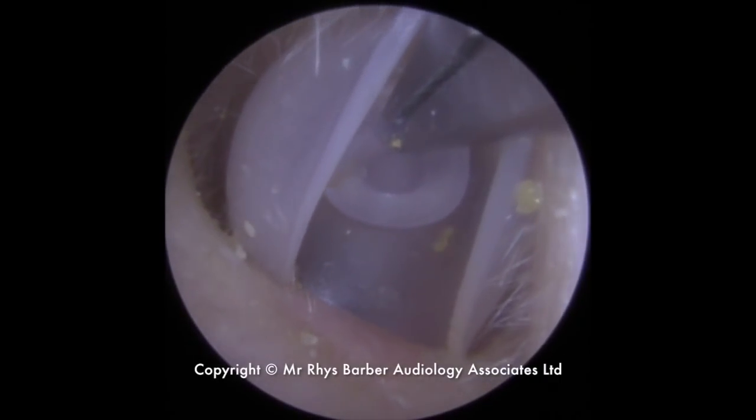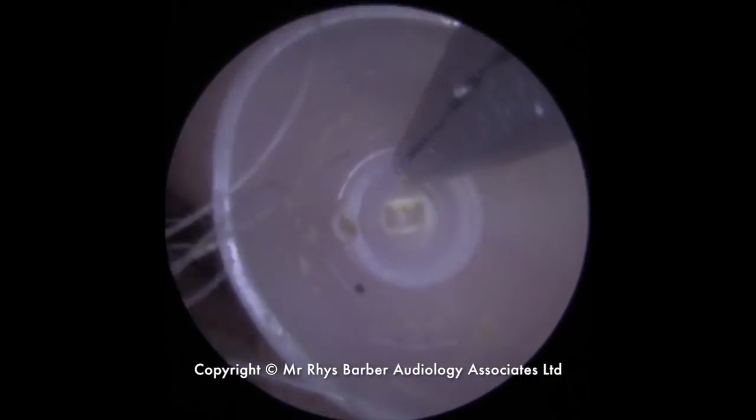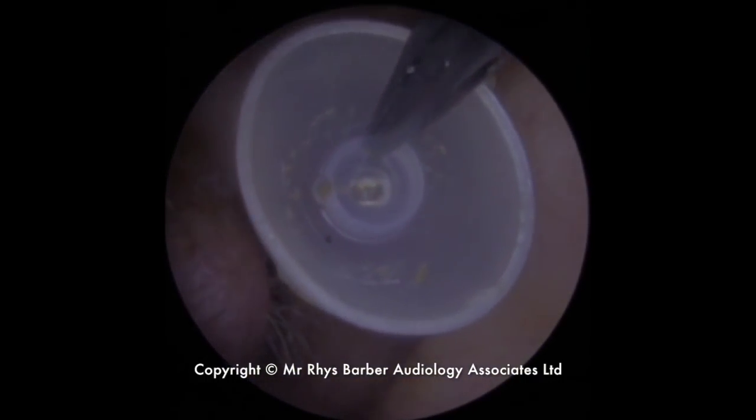You'll see it's made of a very soft silicon, so it's bending as we're pulling it out. But this was really blocking this gentleman's ear canal off and he couldn't use his hearing aid while it was stuck in there.